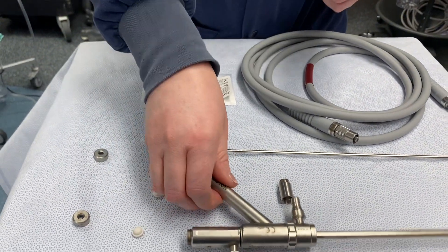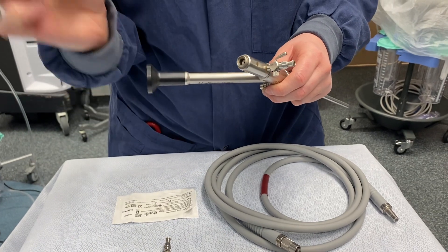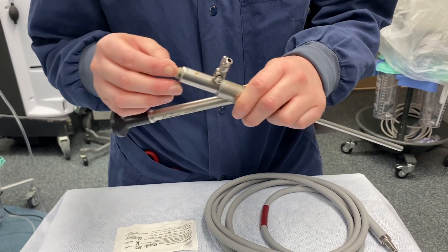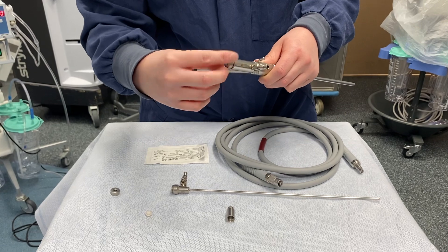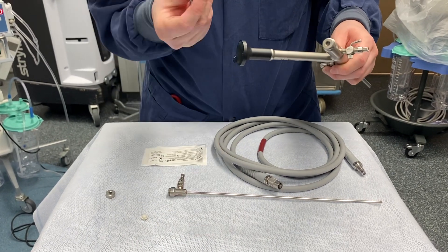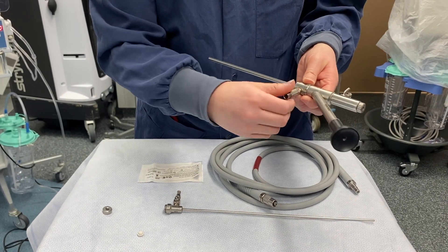Let's start with the scope itself. You'll take your little white seal — the bubble part will point down towards the bottom of the scope — and you will put your metal cap on and twist that on. You want to make sure you have the right light cord adapter for your light cord, and that will twist on to the light post.